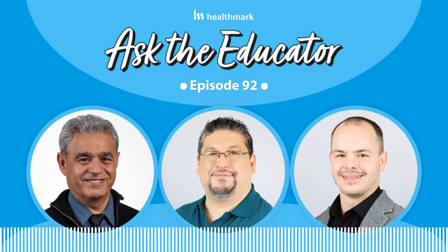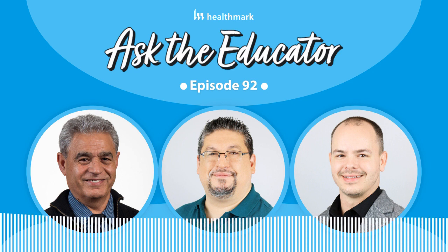A fire started while the surgeon was using it. The hook was attached to the monopolar cord. The cord frayed near the plastic end, came off, fell into the pocket of the drapes, and started the fire. So this is one example.